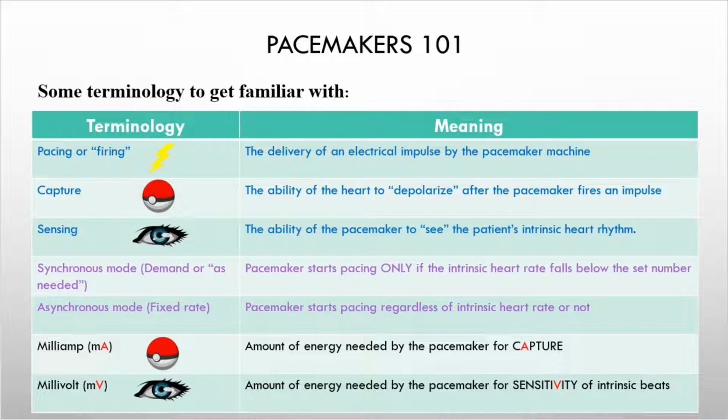Okay, which brings us to the two modes. So on demand is as needed. The pacemaker starts pacing only if the heart rate falls below the number that we set in the pacemaker. Asynchronous mode just means that the pacemaker will start pacing regardless of whether the patient has an intrinsic rate or not, meaning that in asynchronous mode, the pacemaker is not going to sense, it's only going to pace.